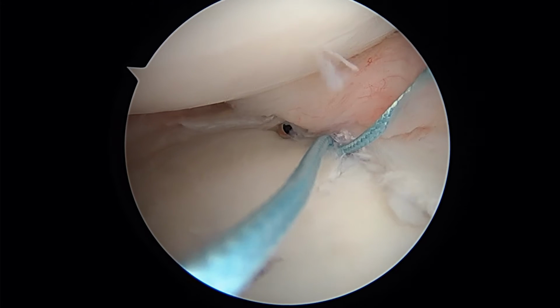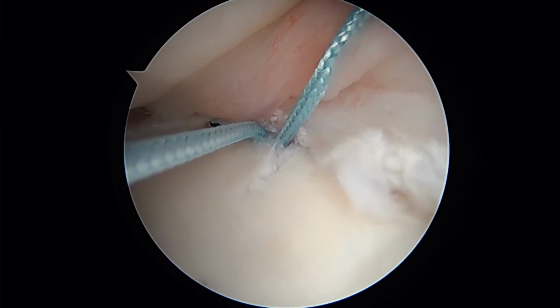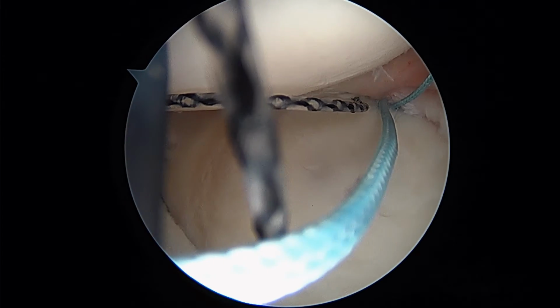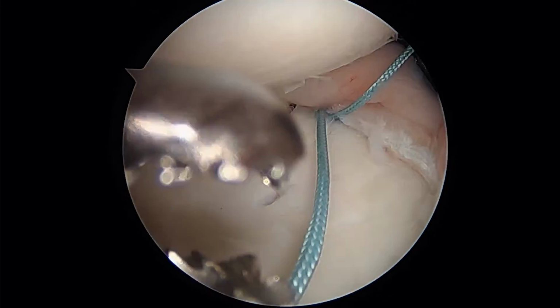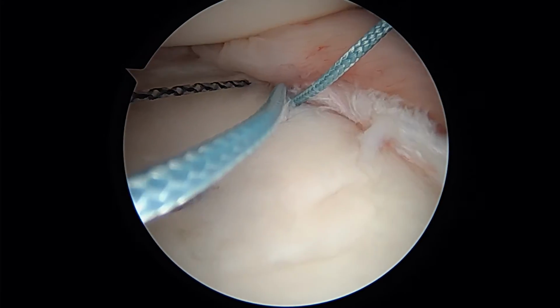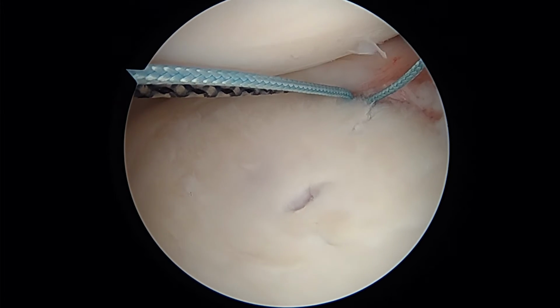So here we are, peeking underneath there. You can see the tip of the relay. Just a minute, you'll see the tip of the relay. Hold the camera there with the other hand. There it is right there. And now the trick here is to retrieve it. Hold the suture hook. We'll retrieve that right here. And then outside your shoulder, we're going to load that black wire with the suture that's going through the same cannula. You can't quite see it.